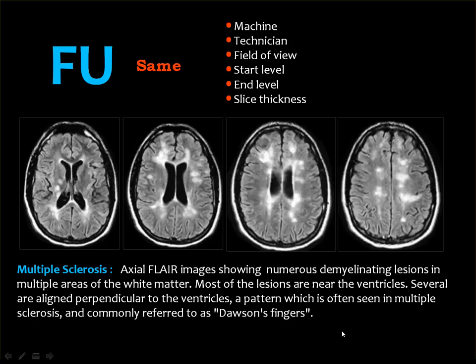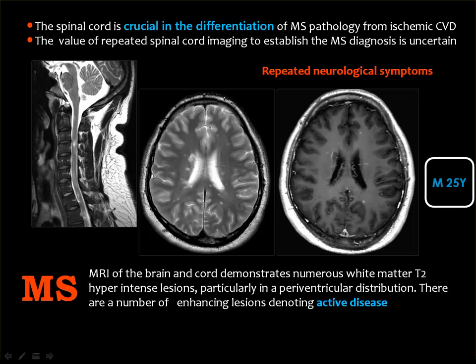I think it's impossible in Egypt, at least. Then if you got these similar criteria, you can put the two examinations on the computer, then the software will start the comparison, and the result will be no change, regression, progression, and so on.